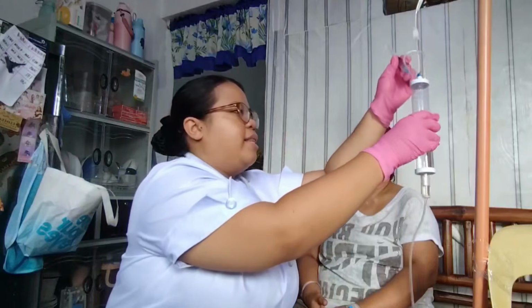Then after that, we're going to administer our medication, which is ceftriaxone. Okay, so we're going to incorporate this here.